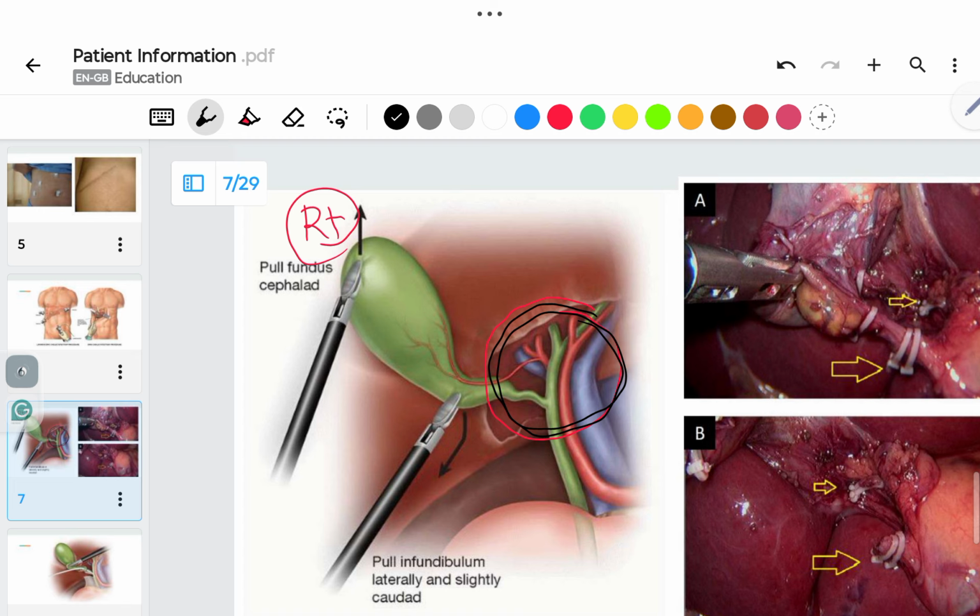This is important, and no gallbladder surgery or cholecystectomy should be done without establishing clear anatomical boundaries. You can see here the gallbladder is attached to the bile duct via cystic duct and a small artery which normally comes off the right hepatic artery, or right branch of the hepatic artery, which is here, which is the main artery that goes into the liver.